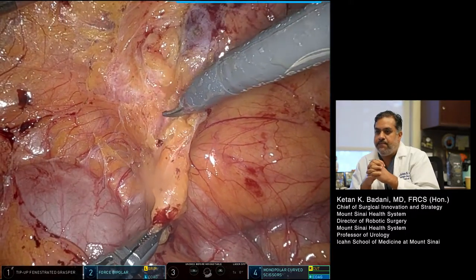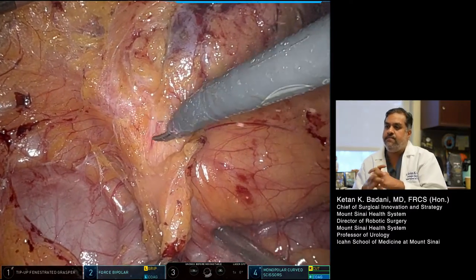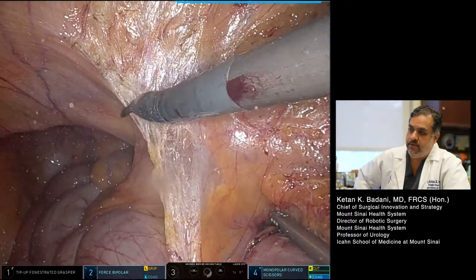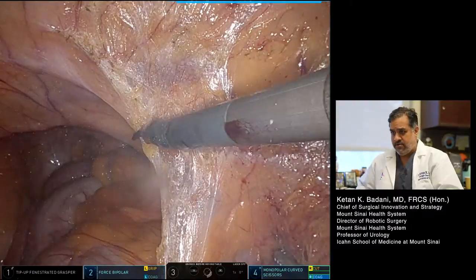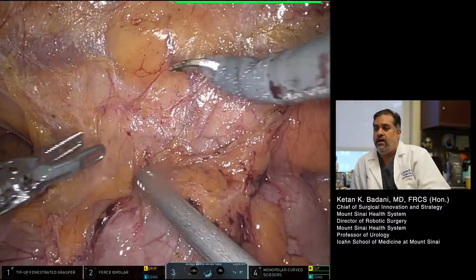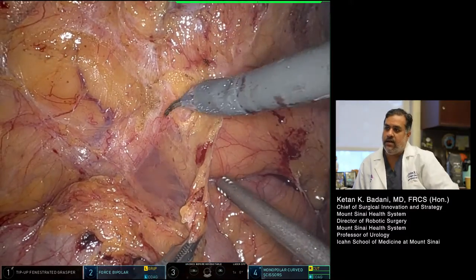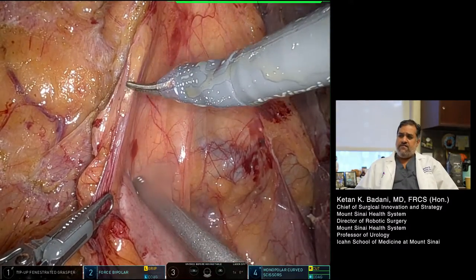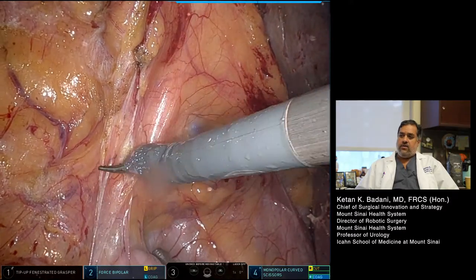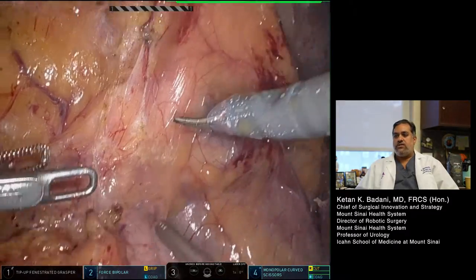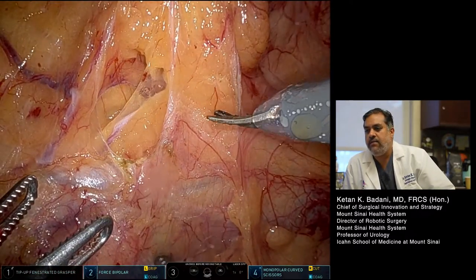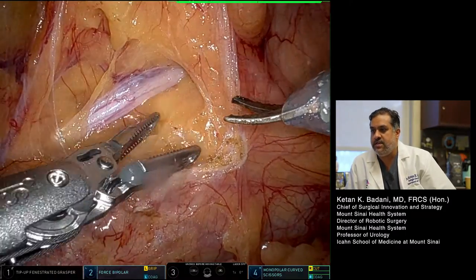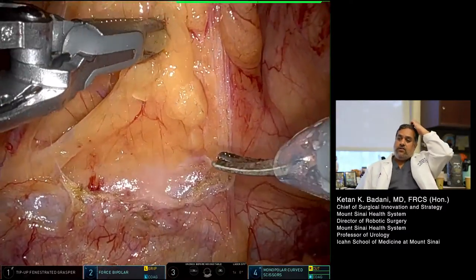Now we're going to go to the next step: reflection of the colon and duodenum, and identification of retroperitoneal structures. I grasp the fat and incise a solid one to two centimeters far from the colon, then reflect along that line — my left hand pulling down as I'm dissecting, creating the space. I'm very far away from the bowel line. You can reflect this as far down as you want and risk no thermal injury to the bowel. You're going to identify the yellow fat of the retroperitoneum versus the yellow fat of the peritoneum — a very clear difference in color.